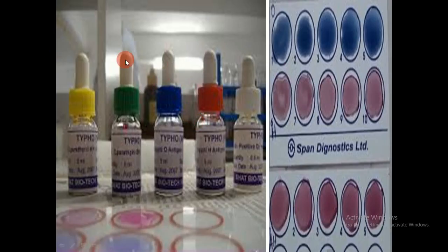And this is the Vidal test, and this is the antigen and the antibody present in the serum of the patient, and we do this agglutination. If there is lattice formation, it is positive, and if there is still a suspension, it is negative.